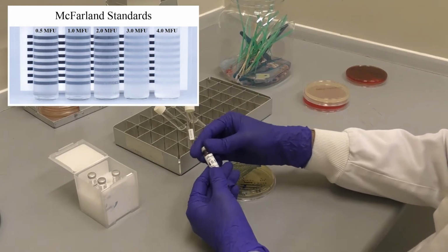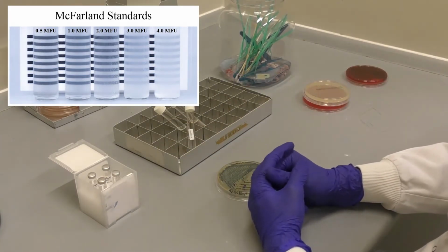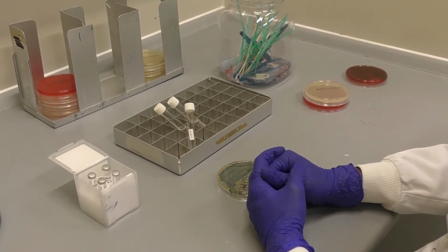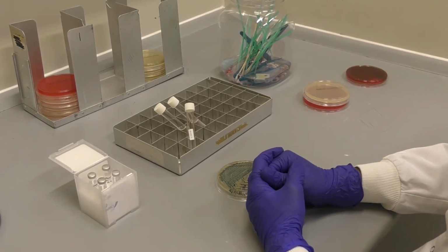You may need to adjust the turbidity of the suspension by either adding more organism or more saline to achieve the 0.5 standard. It's crucial that the density of the inoculum is neither too dense nor too light, as this will alter the zones of inhibition and thus the antibiotic resistance reading. Once you've made the suspension, it must be used within 60 minutes or a fresh suspension will need to be made. It's optimal to use it within 15 minutes. If there's a delay post-preparation, the suspension should be mixed by inversion prior to use.